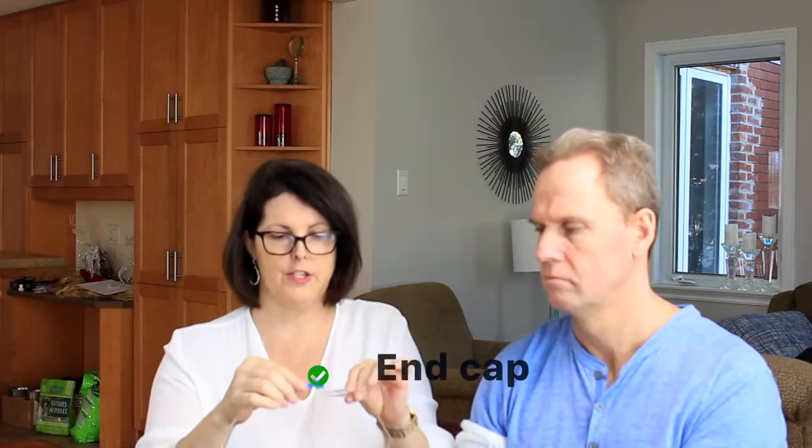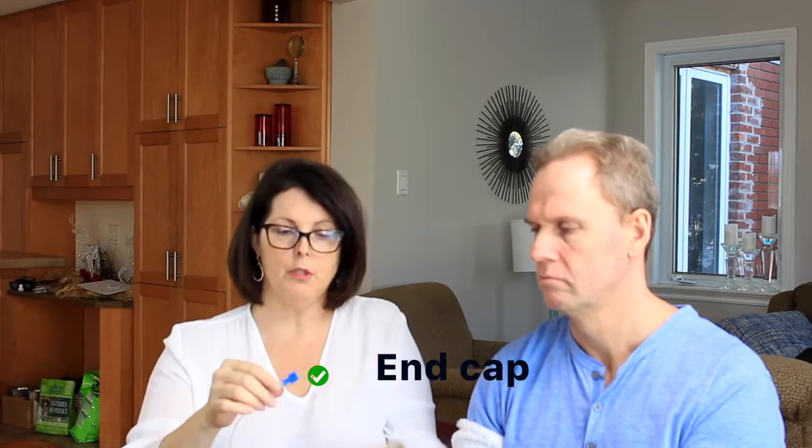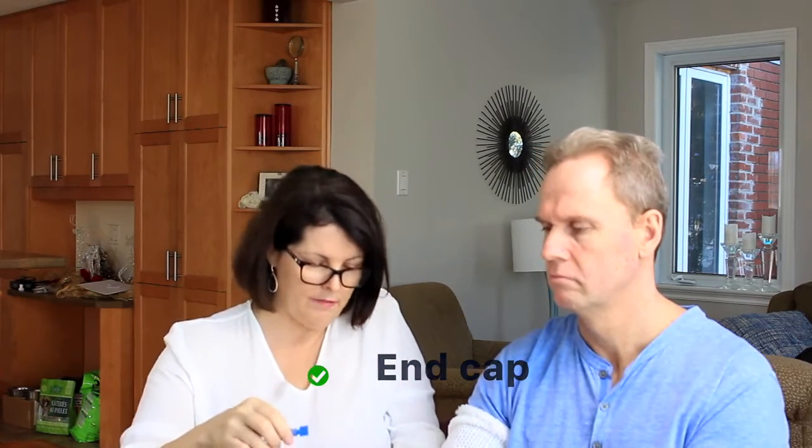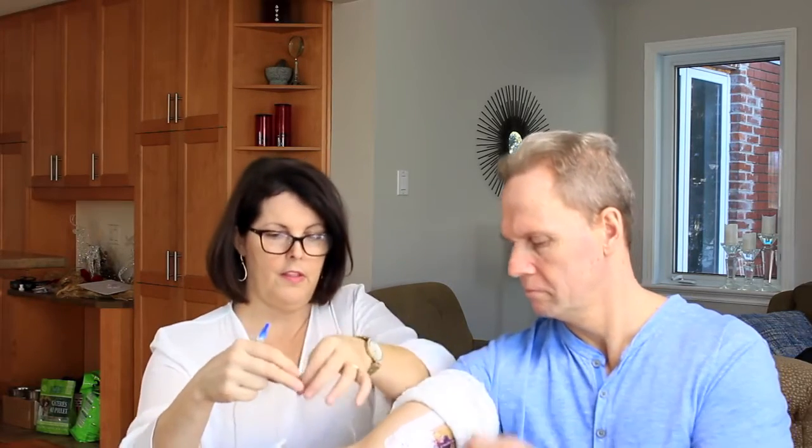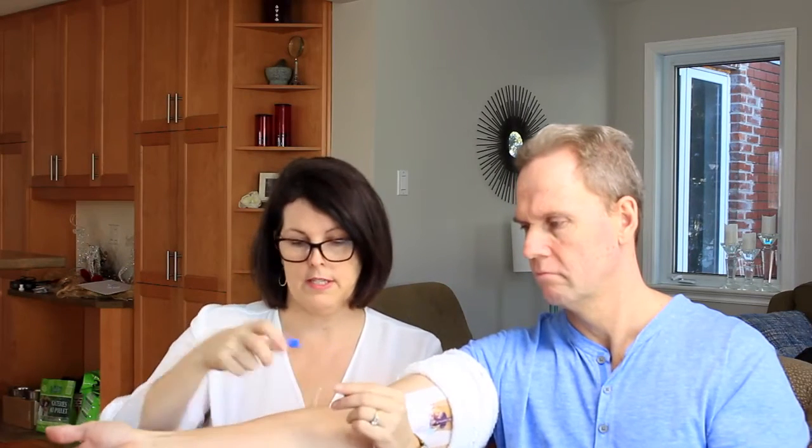At the end of the tubing is a cap. We take the cap off, and then I'm going to show you how to connect it to the IV. And then that fluid will start to flow, and it flows directly into the IV extension set, into the tubing that goes into the vein, and then it flows into his bloodstream so that he can get the medicine. When the medicine is finished, you're going to simply take this tubing off of the bottle.